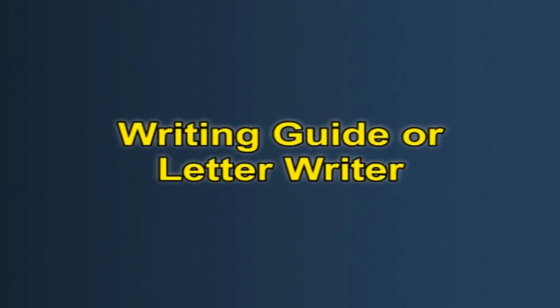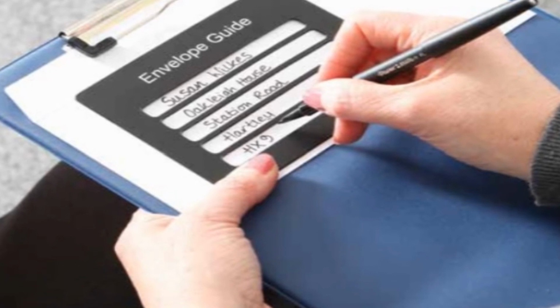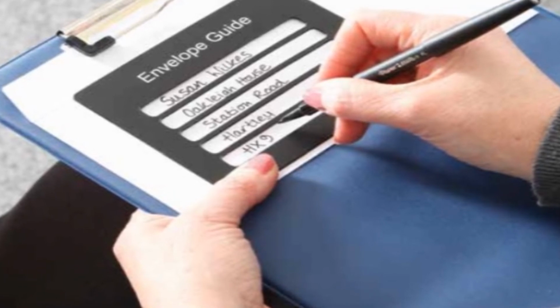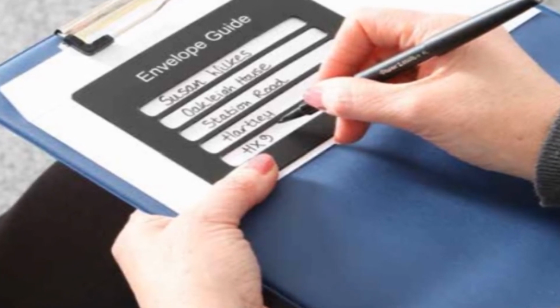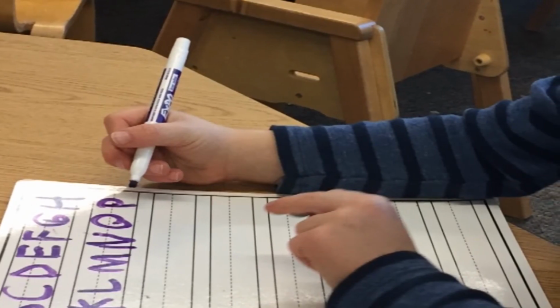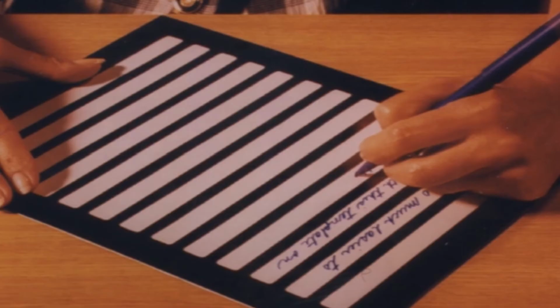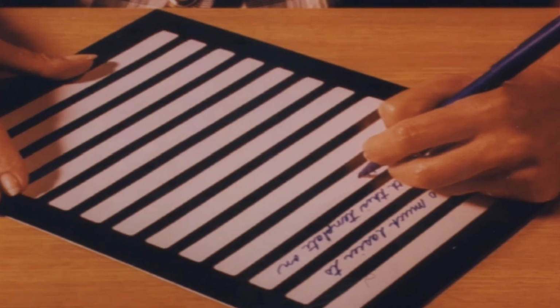The next device is the writing guide or letter writer. The writing guide or letter writer is like a folder with rectangular slits. A sheet of paper is placed inside it for writing. It helps the person with low vision to write in straight lines without any glare. Even children with normal vision who have problems writing in a straight line can use this for training purposes.